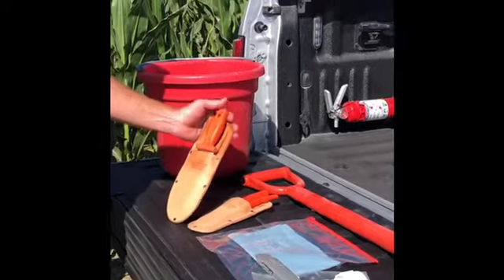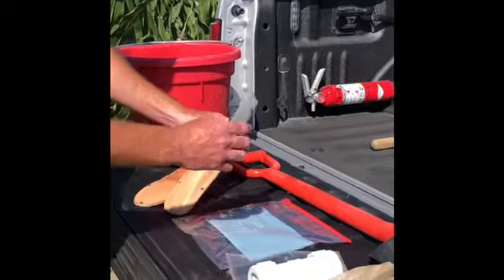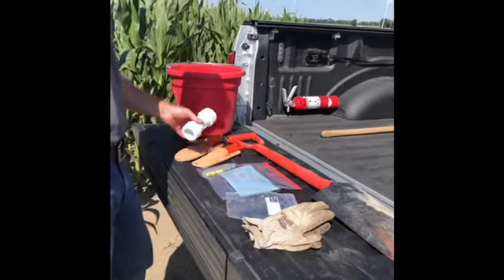I often carry a smaller shovel for smaller sampling. Again, later in the season if you need to look at stalk rots, carry a pair of shears or knife, or even — as long as you're wearing gloves — make sure you use a stalk splitter if you're looking at stalk rots or want to get stalks to the lab.